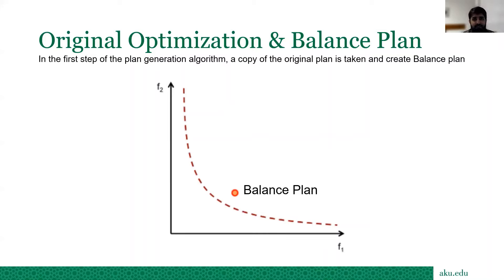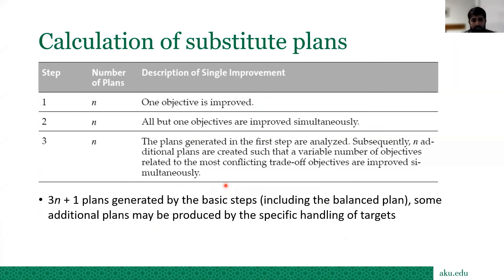Once you have made the plan, you run MCO and the system generates the balance plan out of your best plan. The Pareto surface is this line, and our plan lies somewhere here. The calculation of substitute plans is done by this algorithm: if there are N objectives, it multiplies N by three and adds one to generate the basic steps — so it generates 3N+1 plans depending on how many objectives you have selected to trade off.